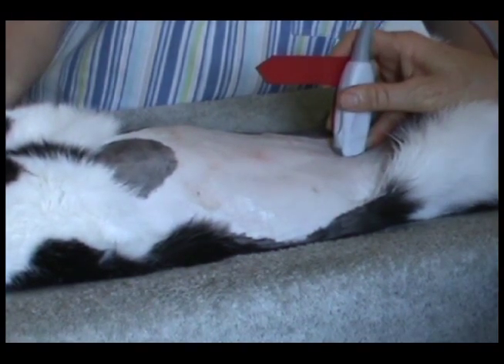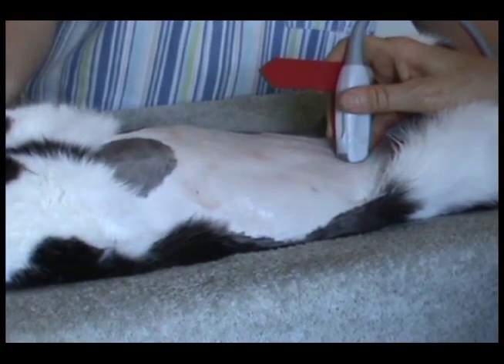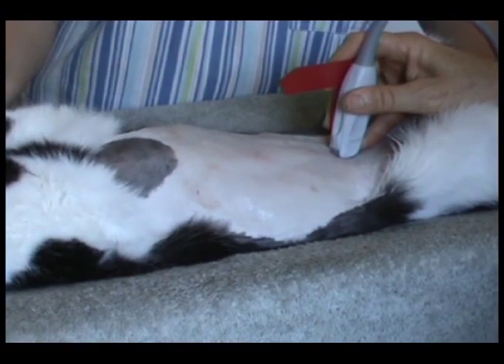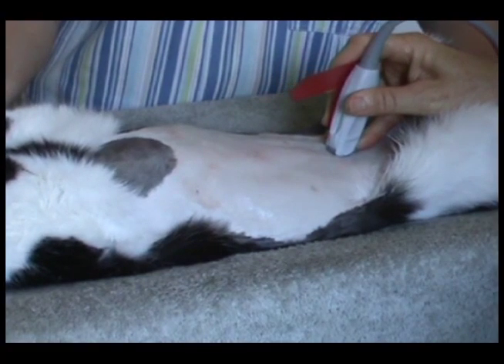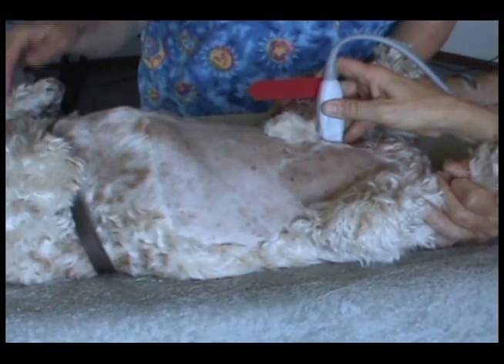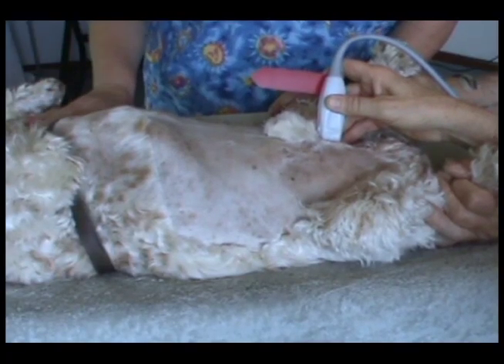enlarged mesenteric lymph nodes. We will use a 16-pound cat to find the urinary bladder. Remember to keep the organ centered on the ultrasound screen to reduce artifact. This is best accomplished by holding the transducer perpendicular to the patient's body and the organ of interest.